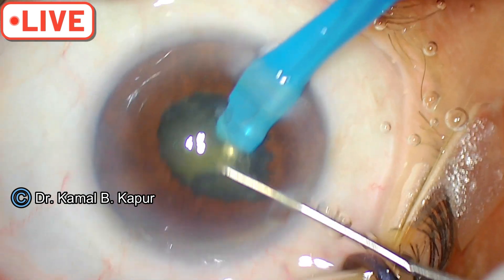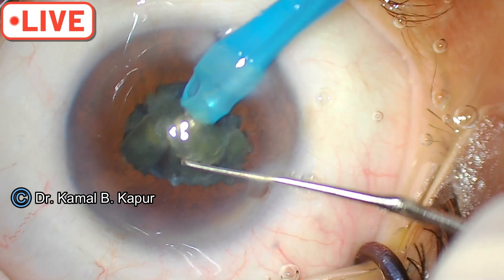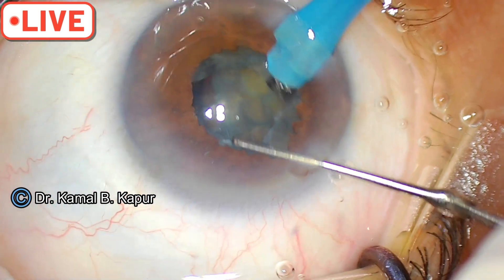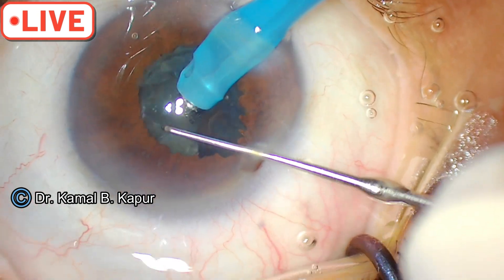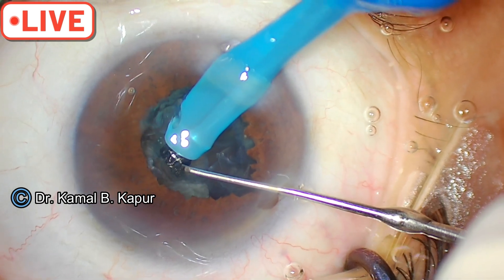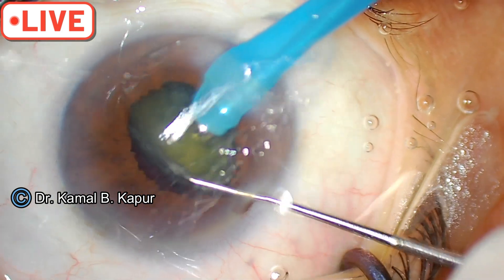You can pull the quadrant up. Make sure you try and do things in the middle, in the pupillary plane — don't go deep. Rotate your nuclear fragments. You can keep chopping. This is not exactly a very hard cataract, so you may lose grip while trying to chop.